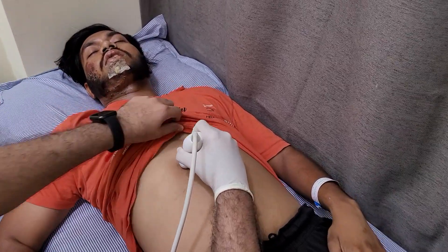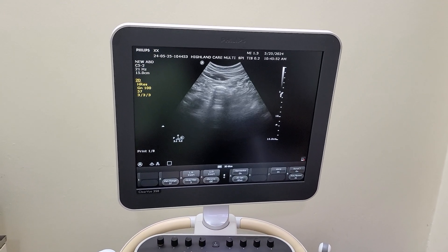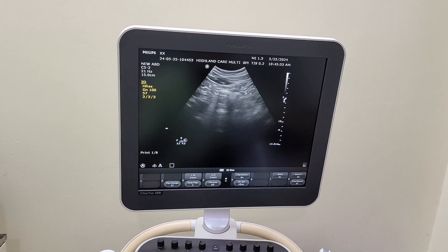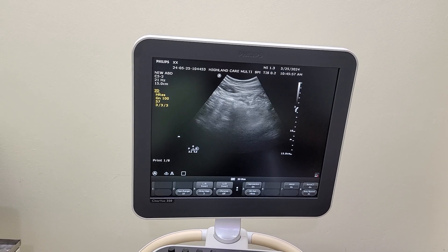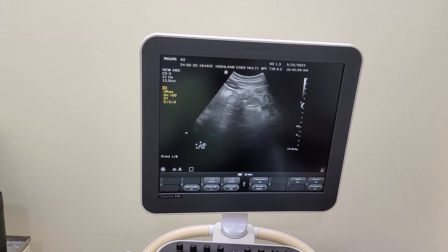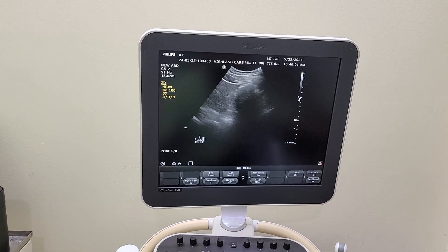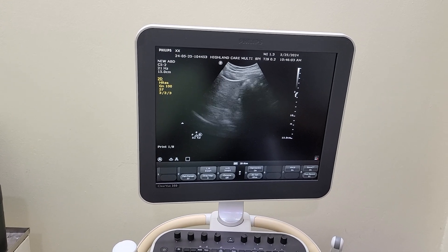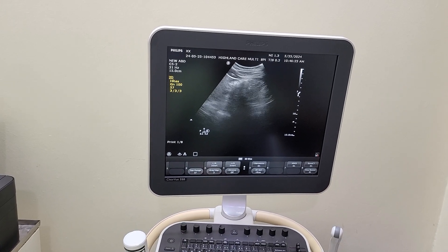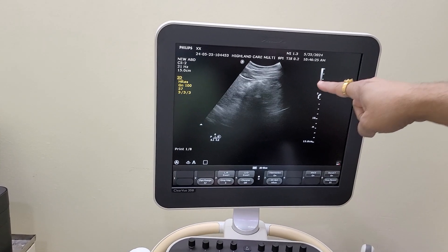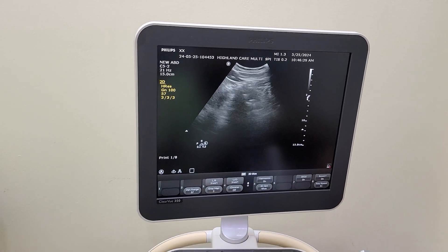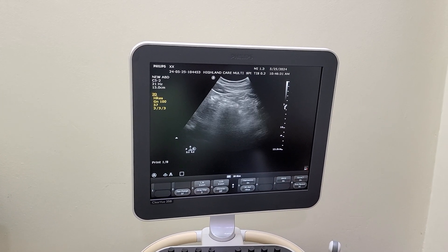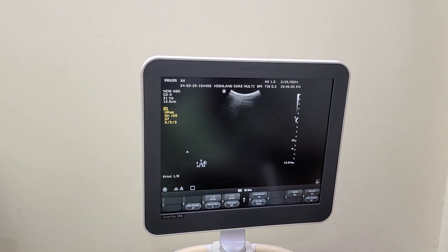We are starting with the sub-xiphoid window, looking towards the pericardial window for any tamponade. You can see this is the heart, and we are not seeing any evidence of pericardial effusion in this.